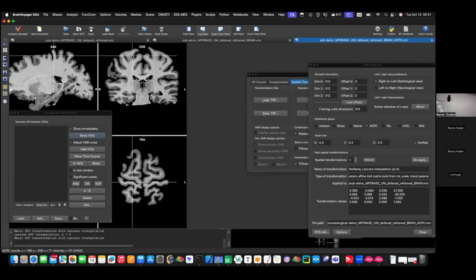And in the whole AI community, people mainly use Python, so that's actually what people usually want. In BrainVoyager, it is like an executable because you don't have to touch Python. It just does it for you. You could wrap it yourself with a little exe, which is 10 lines of code. It's simple, but normally people want the Python, because it's flexible.